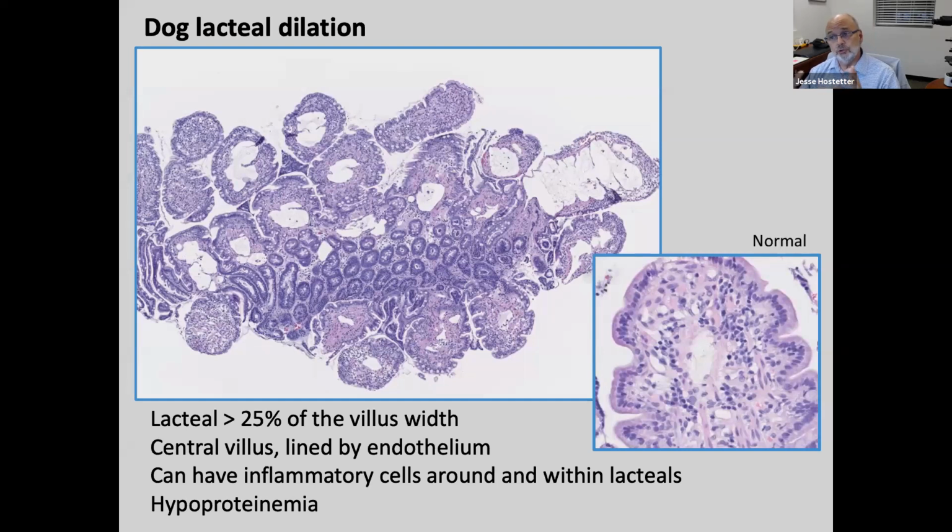The images I showed earlier of the epithelial injury, oftentimes that epithelium is leaky, especially if there's erosion, then it's going to be really leaky, and that's associated with PLE or protein-losing enteropathy. And as I'll show in a couple slides, crypt change or crypt abscesses can also be associated with protein-losing enteropathy as well.